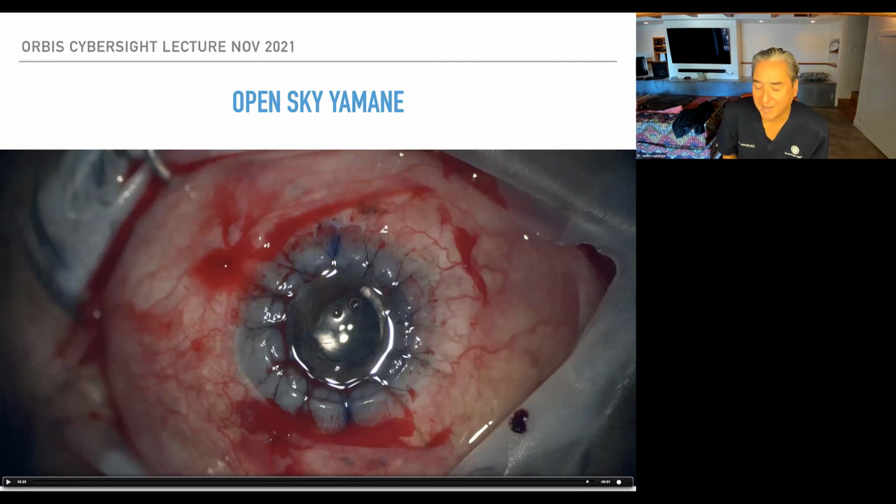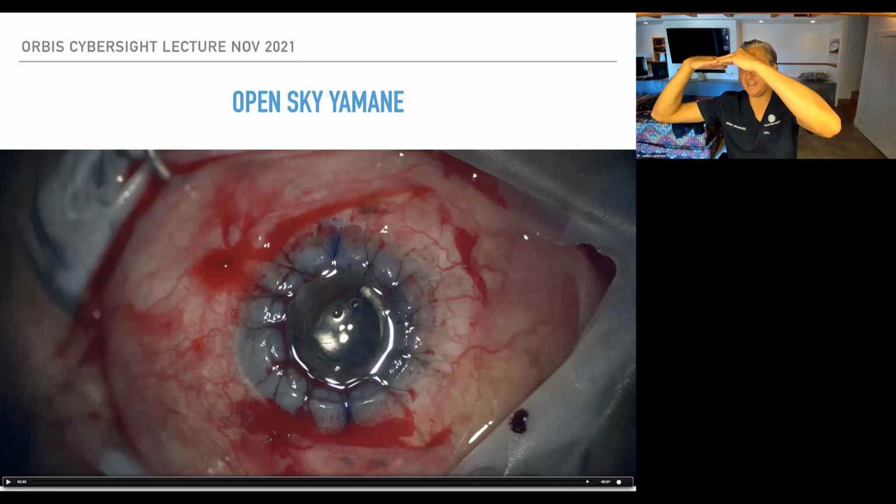Dr. Almusa asked, why do you not go for a big CCC rather than can-opener capsulotomy or capsulorhexis? I have tried both, and it's very tedious to do a CCC in these eyes because you can't put in viscoelastic and flatten the anterior capsule. It's very round because the eye is open, and it has a tendency to go out.